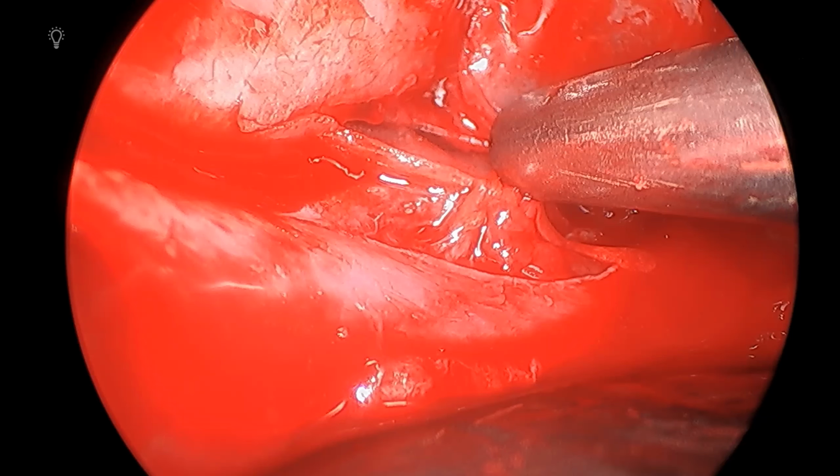But I usually measure that distance. Everybody talks about the lengths, 33 millimeters, 25 millimeters, but really it's how you're going to rest the plate. Are you going to rest the plate over the inferior rim or behind the inferior rim? So what I'll do is take my thumb and rest it on the inferior rim with the Freer, and then rest it to the posterior shelf, and I'll use that as my measuring stick for the plate. But it's very important to have all this structure reduced when you rest it.